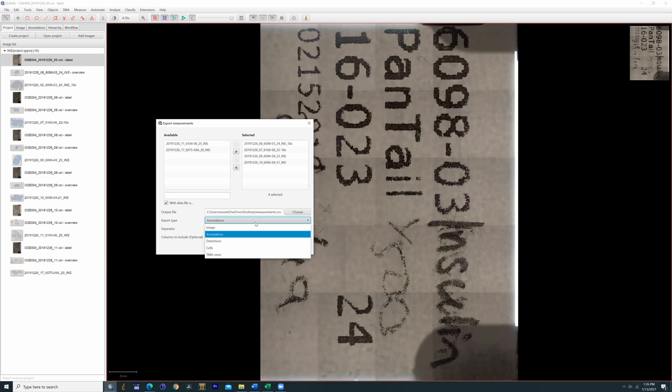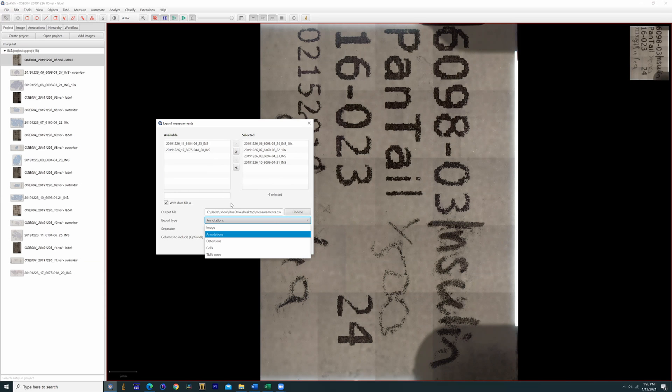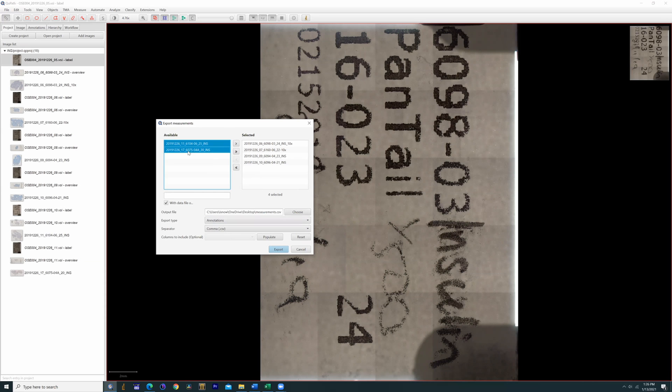There are other options here, but if you try doing something like cell where it stores all the information, these files will become significantly larger. A single file I tried to export, because you're trying to account for every cell and every measurement of every individual file, these things will quickly grow to be several gigabytes in size and probably very difficult to work with. I'm not even sure if you can open them in Excel. So anyway, we're going with annotations because we just want to save the numbers for the individual accounts. In this case, let's put all of them, just for fun, put all of them over. And now we're going to go under populate.